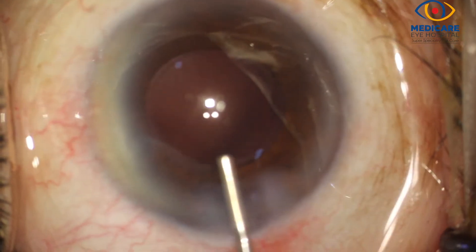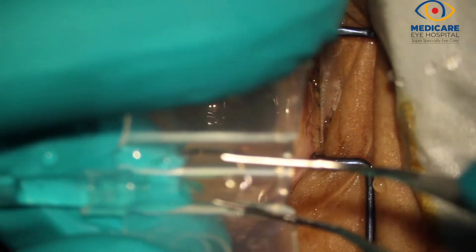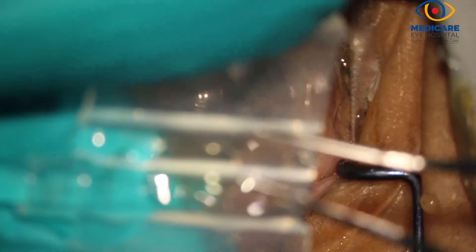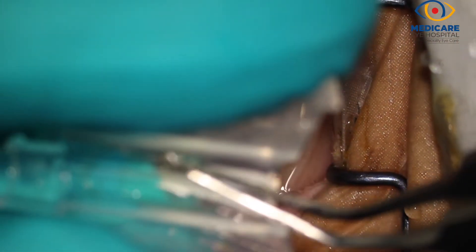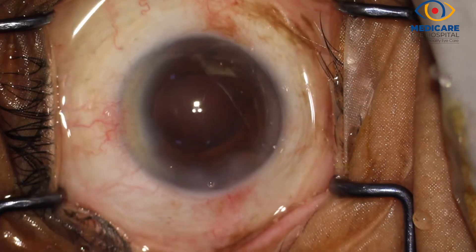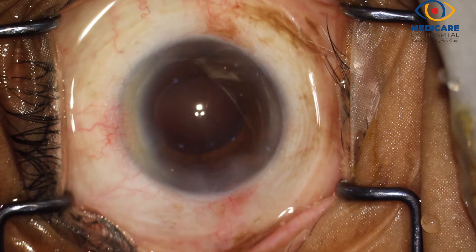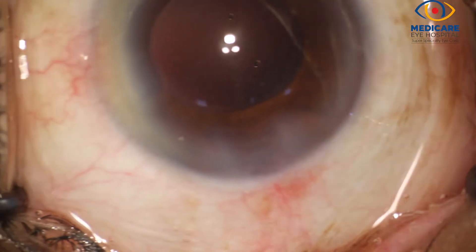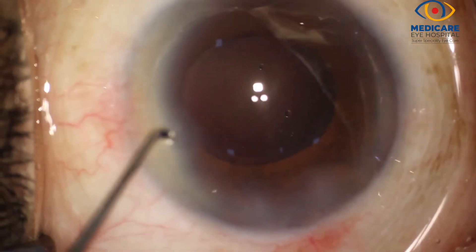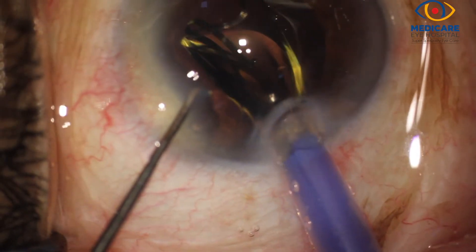Now the capsular bag is inflated with viscoelastic. A hydrophobic acrylic trifocal intraocular lens is then loaded in a butterfly type cartridge under the operating microscope after thorough examination. This cartridge can comfortably pass through a 1.8mm corneal tunnel, and this incision is 2.2mm, which allows easy access for cartridge entry as well as intraocular lens implantation.